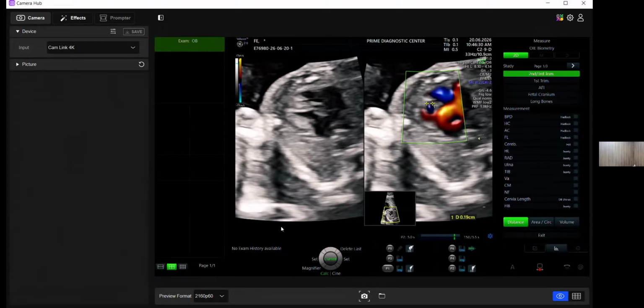So once you're in the sagittal plane, you imagine this is cranial and this is caudal. Where is the problem? Once you are doing this, you presume one end is cranial and one is caudal. Agreed? So now you're scanning. Let's say if I see the clockwise here, I expect the head to be down. And down is not actually the mother's down. Down is actually on the left side. So I scan and see, and it's there.